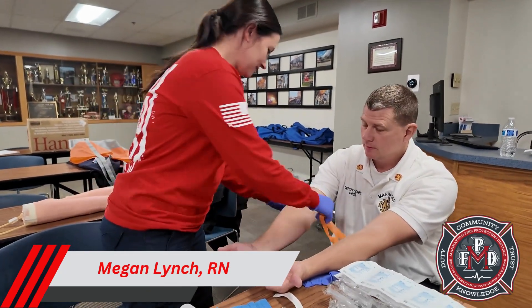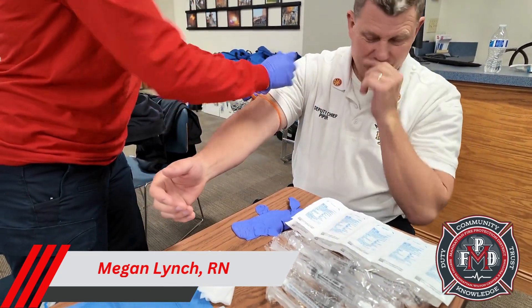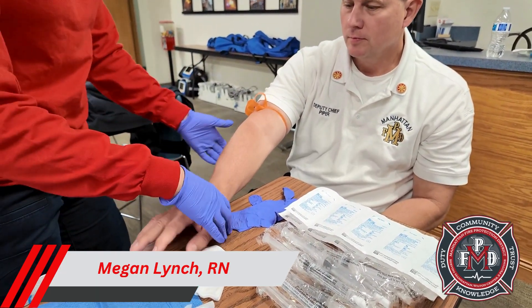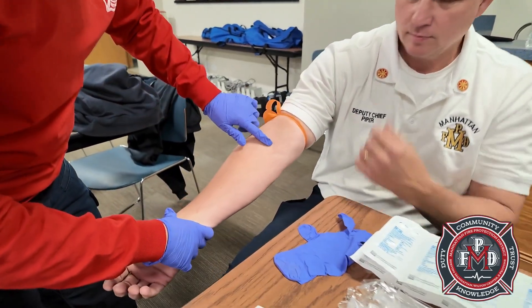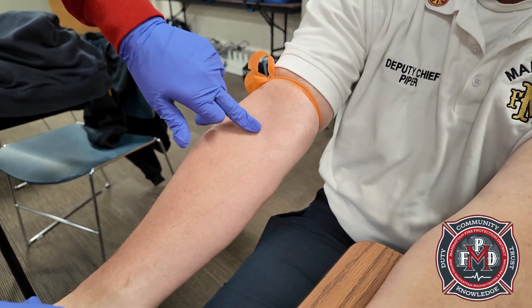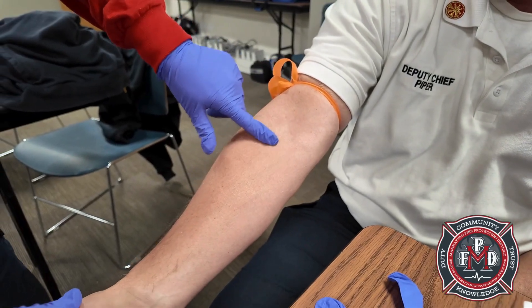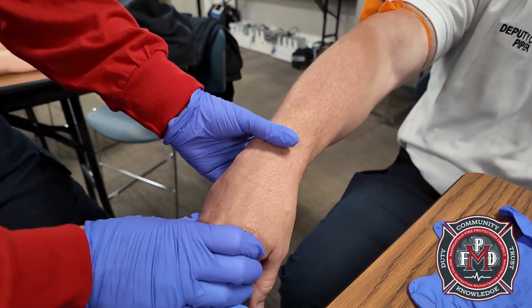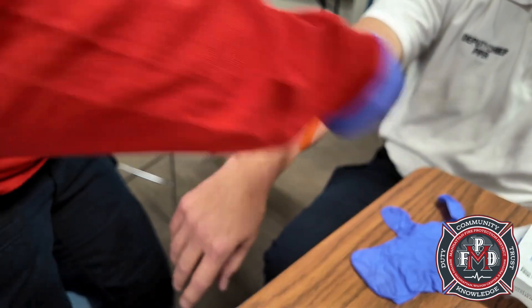Let's see all the veins we have here. We're going to put this tourniquet all the way up above the elbow and check all the different sites. You have a good AC — see how you can't really visualize it very well, but I can feel it, so that's a good one. There are all kinds of forearm veins and hand veins. We'll move our tourniquet down.